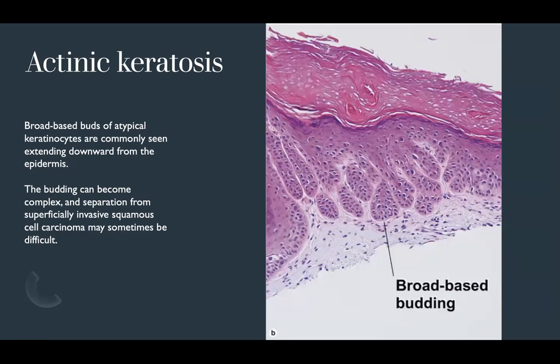Actinic keratoses can also have broad-based budding, with bulbous budding islands extending downward from the epidermis. Depending on how much basophilic staining they take up, they could be confused for a superficial basal cell carcinoma. Doing a BerEP4 stain to confirm it's negative can really increase your confidence that it's just an actinic keratosis. The budding can become complex, making it difficult to separate from superficially invasive carcinoma, especially with tangential sectioning.